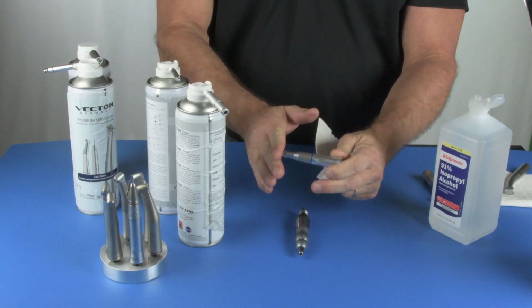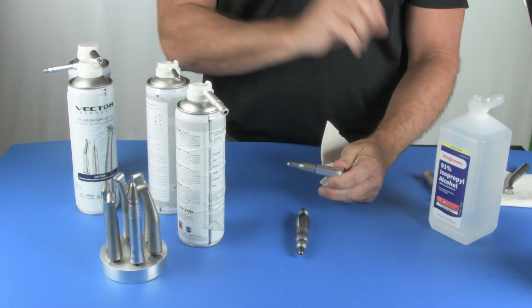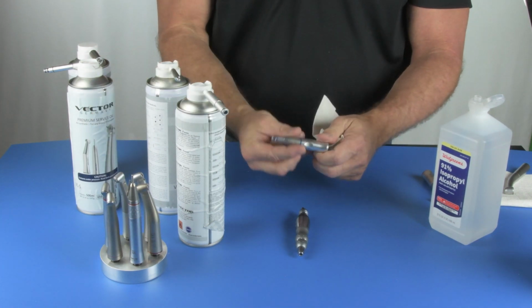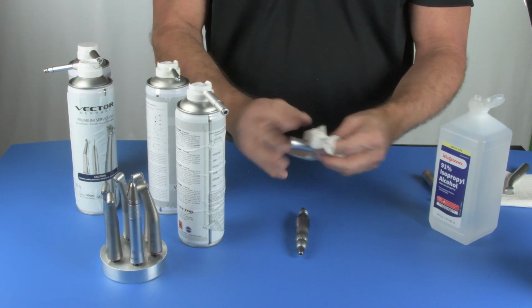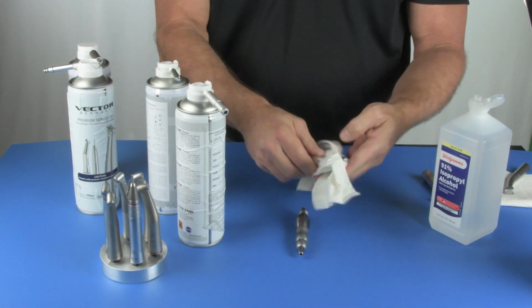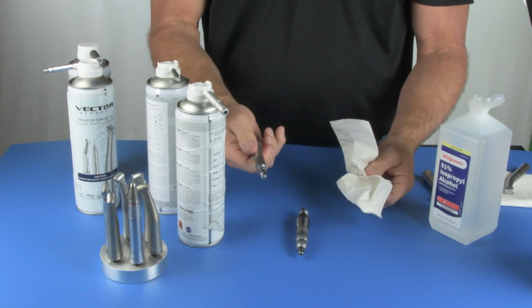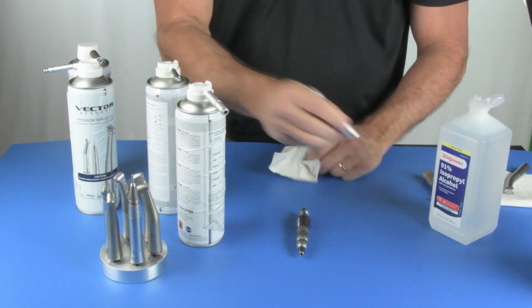And that also goes for any model that you see from any type, from electric to air driven. If it's running out black, continue to spray until it's clear. You're getting it completely clean. After that, you simply take the handpiece nose cone, wipe off with an alcohol 2x2 again, and sterilize. You do not have to run these because they are gear driven.